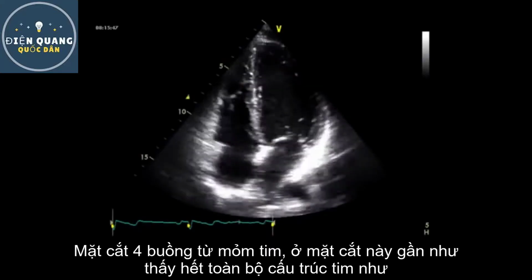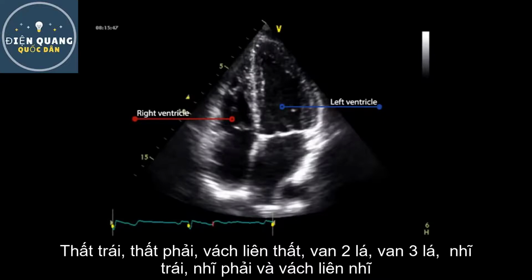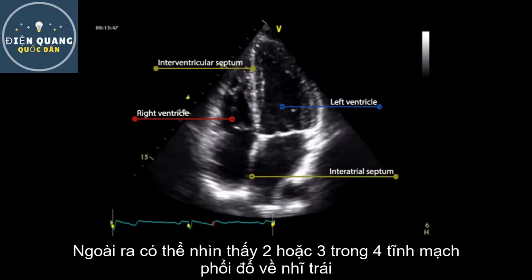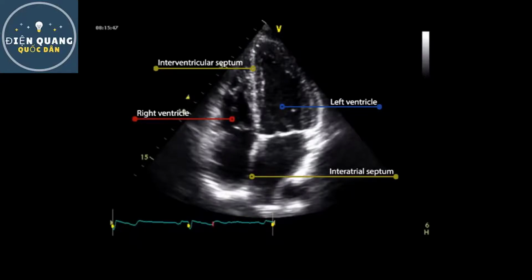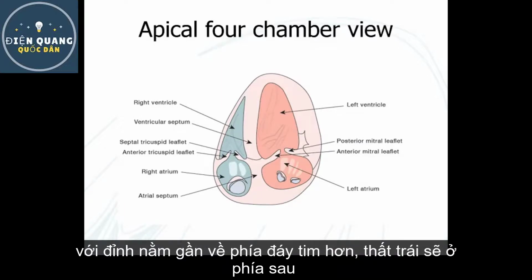In the apical four-chamber view, structures including the right and left ventricular lateral walls, the tricuspid and mitral valve, both atria, and the interventricular and interatrial septa can be seen. It is also usually possible to assess 3 of the 4 pulmonary veins draining into the left atrium. In the normal heart, the right ventricle appears triangular in shape and about half the size of the left ventricle in this view, with its apex closer to the base of the heart than that of the left ventricle.